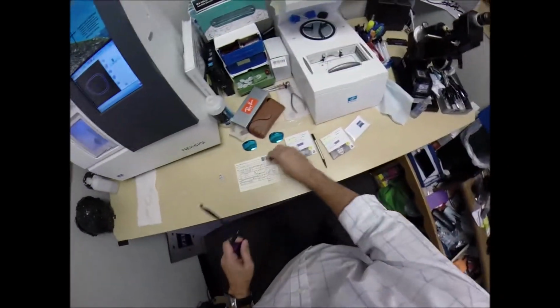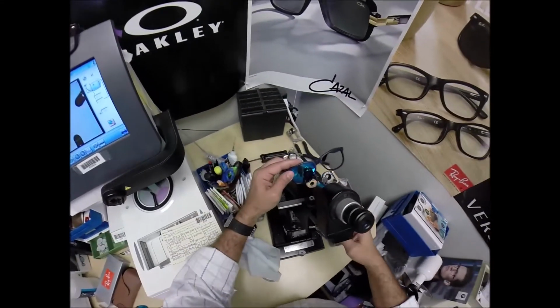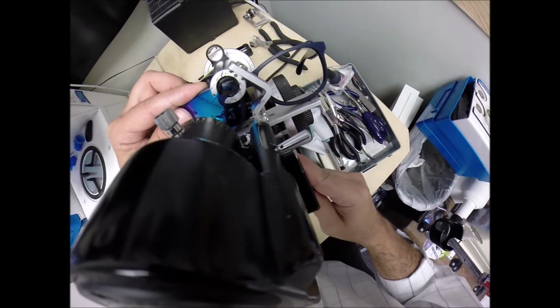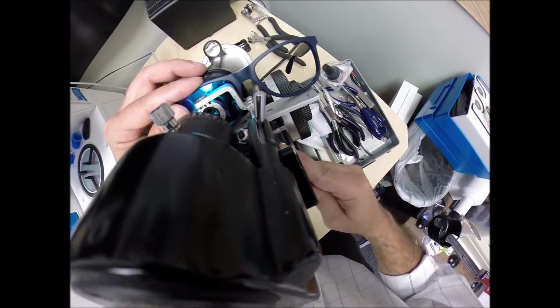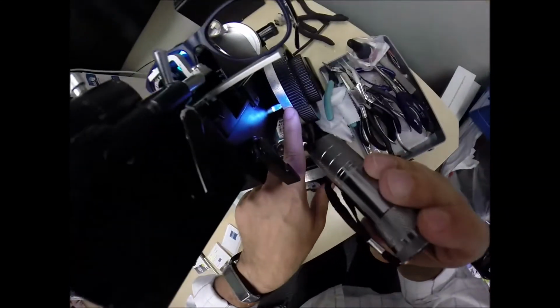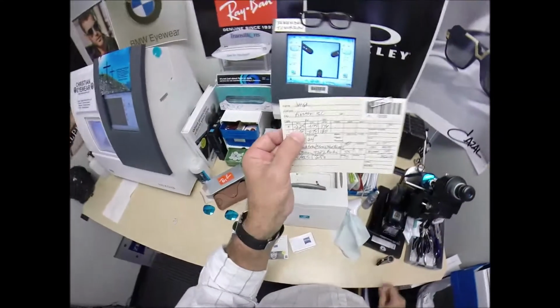let's go ahead and inspect the right lens. Turn that back to 176. Put it in over the dot. Read the power. I'm getting -2.25. One tick mark past 2, going towards 3.